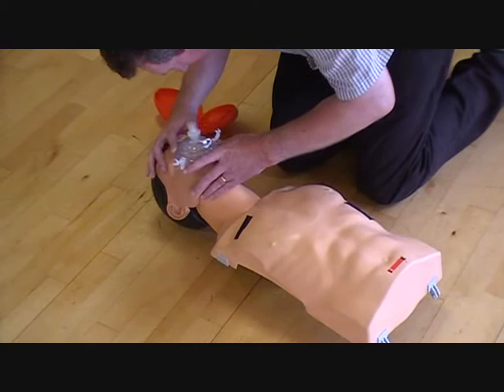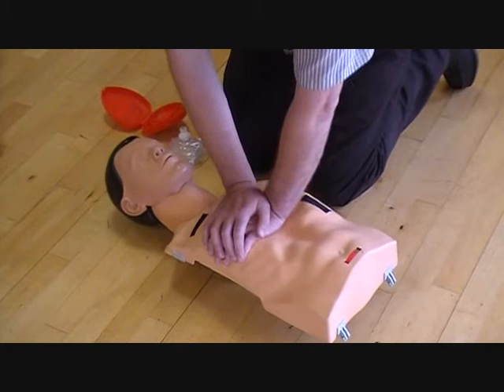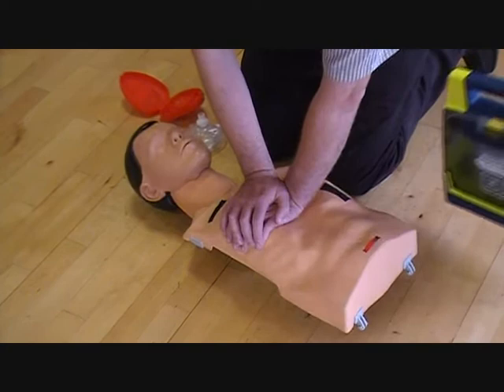Head tilt, chin lift. Second breath. And commence CPR. 1 and 2 and 3 and 4 and 5. And the defibrillator arrives. The very minute the defibrillator arrives, open it.